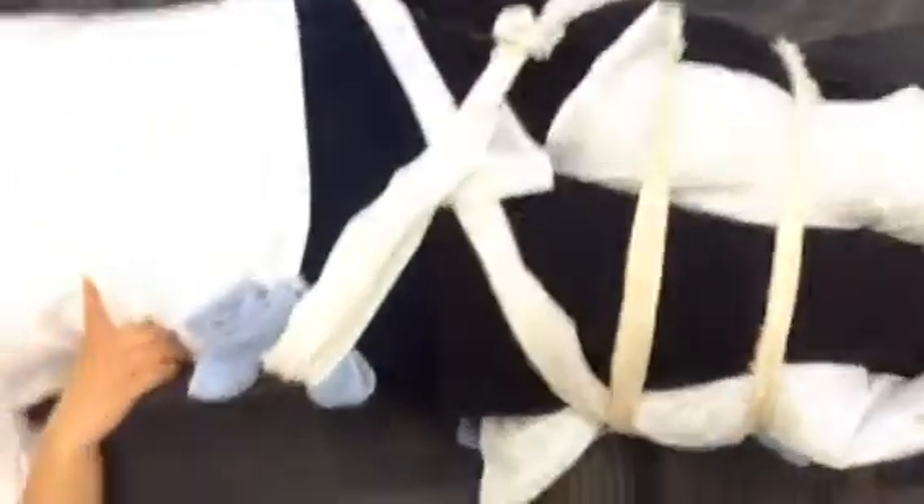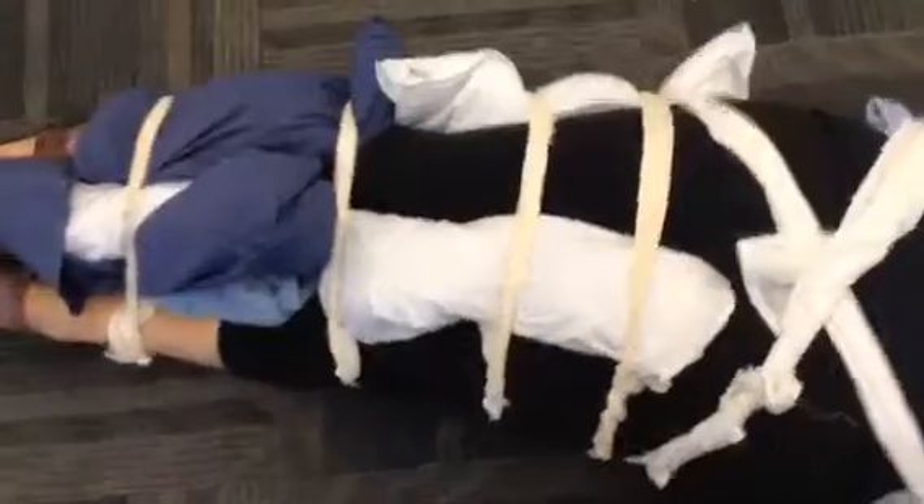Taking a look: landmarking at ASIS, making sure not to go over the greater trochanter, splinting along the outside at the feet, hips above and below, and making sure my ties are secure. We would not be moving this patient until EMS arrived.